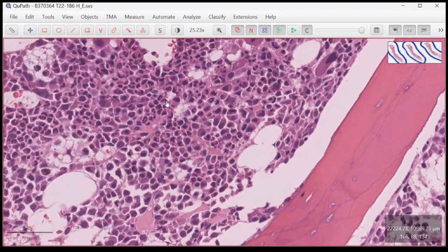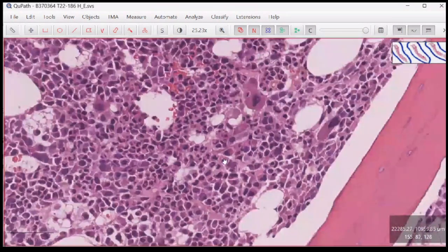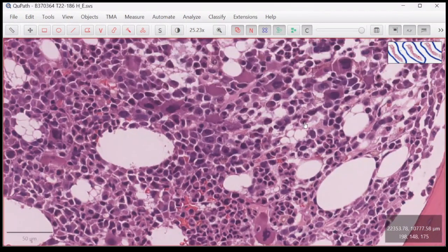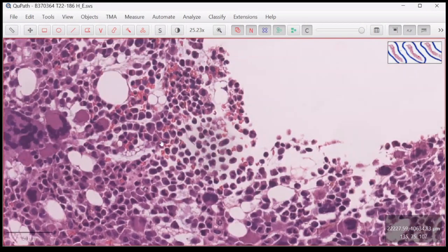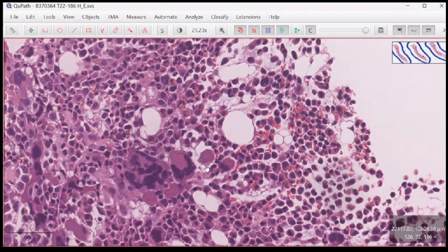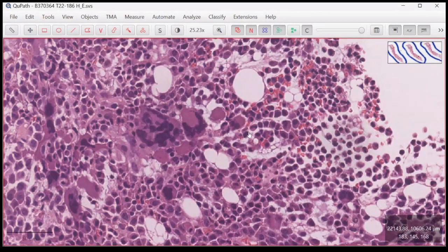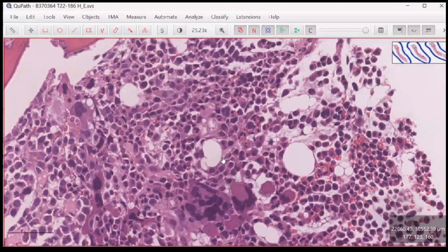Okay, then here we have a granulocytic series with good maturation. You have megas, but where is the erythroid colony, which is supposed to be the first to appear? Forget about this, because unless they are frequent, we do not have to consider some of these dysplastic changes. But in post-chemo, you expect to get all those changes, some dysplastic changes.